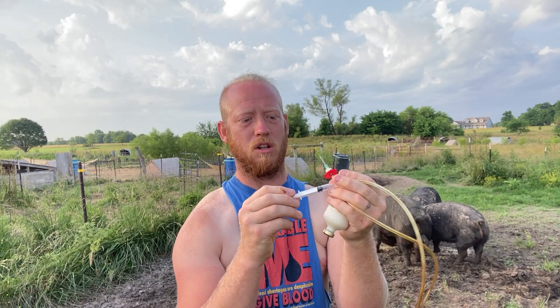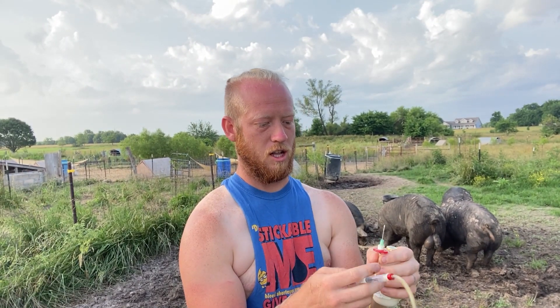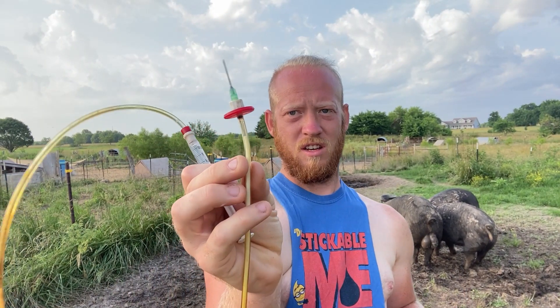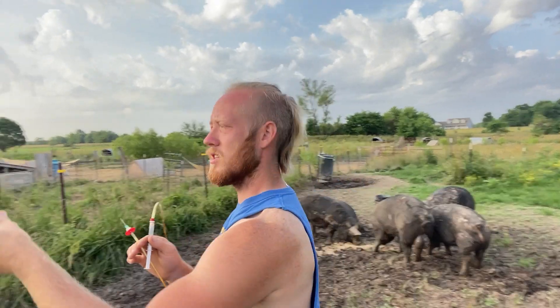So we're gonna go ahead and hop to it. We're gonna pop off the cover, throw that in our pocket, and careful not to stab ourselves. We're gonna pull two milliliters of air in there — a CC and a milliliter are pretty much the same thing, so if your syringe says one or the other it doesn't matter. Hold your bottle upside down, stab the needle in, inject two CCs of air, pull back two CCs. I like to pull just a little bit more because sometimes if you move the slap shot around it'll get funky. Once it's out, pull in another quarter to a half CC of air — it gives you a little air gap. As you move the syringe around, you'll notice that air gap gets bigger or smaller, so we want to keep that as level as possible.